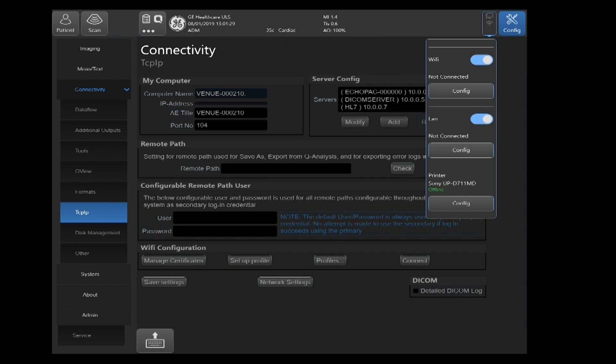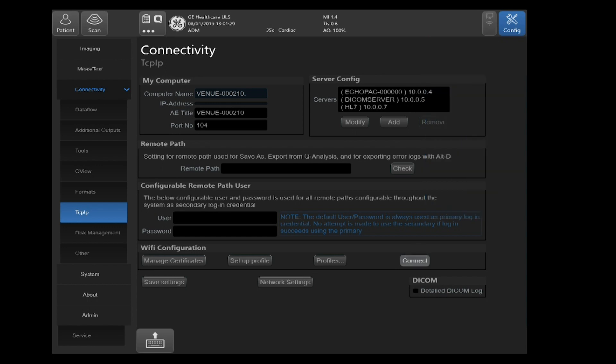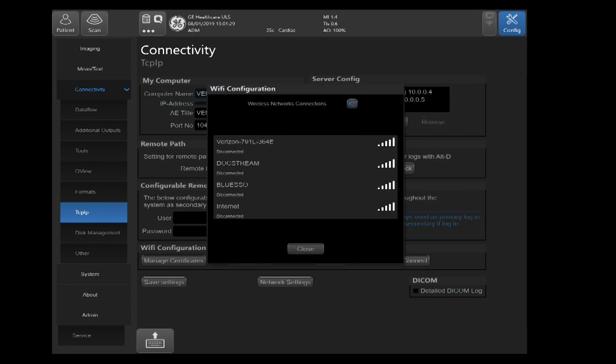You'll be on your Connectivity page. You can select Connect down in the lower right hand corner. You'll see a list of your Broadcasting Networks.